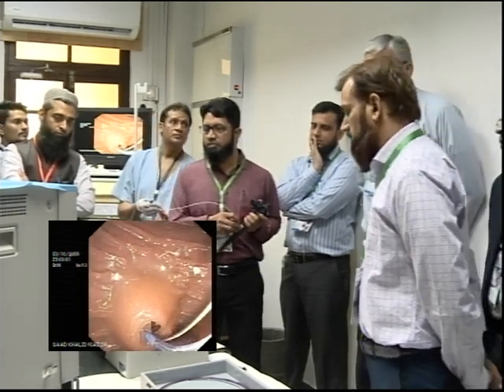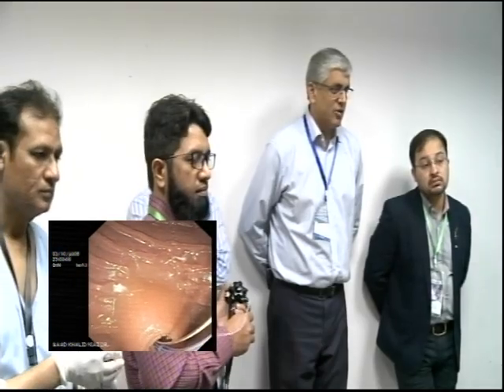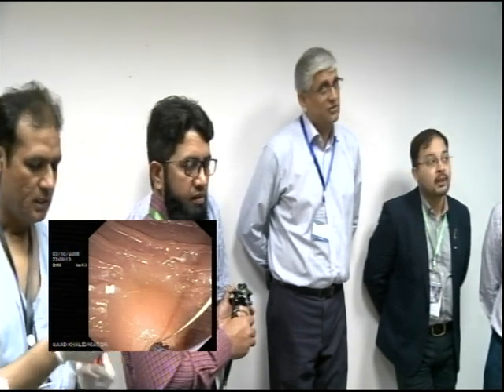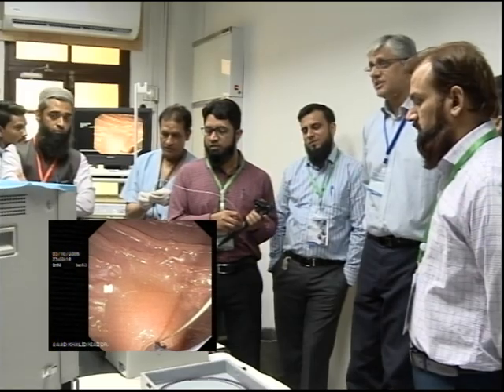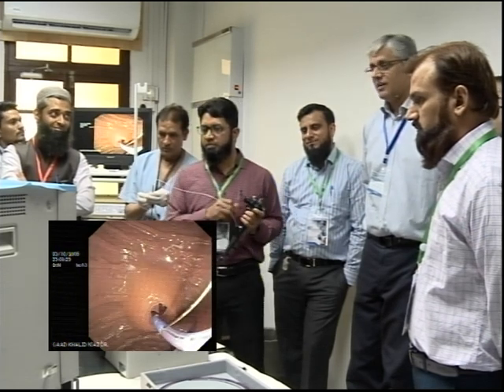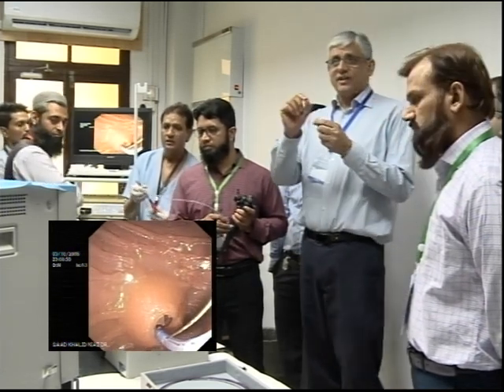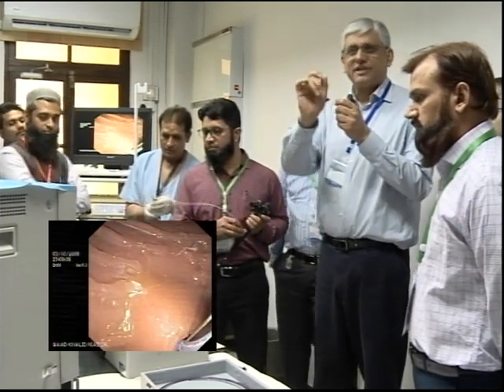One of the problems, and you'll go to a workshop and you'll see somebody else cannulating while you saw your boss struggling. We use cannulotomes as long as they can be used. As long as they can cut, we use them. We reuse accessories there. When you reuse accessories, you can see the cannulotome first time is different, second time may be the same. After that, it changes. So it makes it a little bit more difficult to cannulate because the distal end of the sphincterotome becomes a little not so smooth as it is the first time you're doing it.